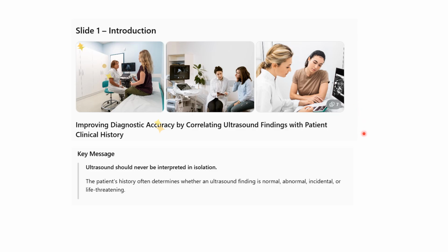Our introduction: improving diagnosis accuracy by correlating ultrasound findings with the patient clinical history. The key message: ultrasound should never be interpreted in isolation. The patient history often determines whether an ultrasound finding is normal, abnormal, incidental, or life-threatening.